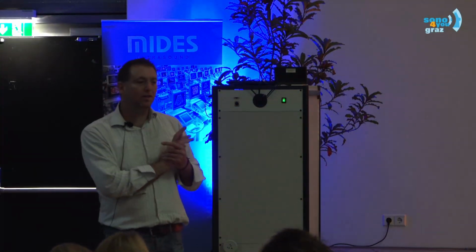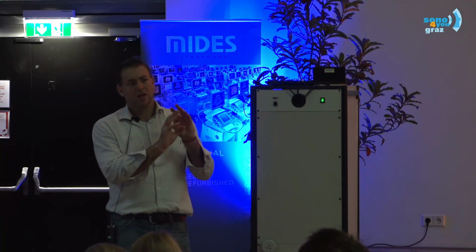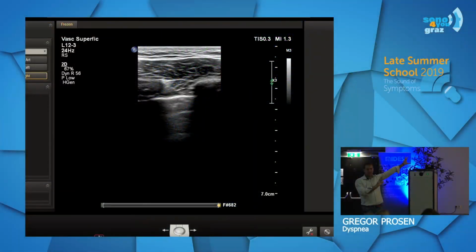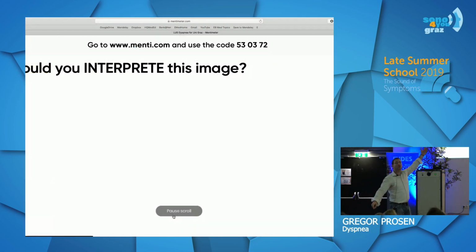Why I want to push you is that you understand that, like with EKG, one thing is to describe this black and whiteness, okay? And another thing is, and we will scroll next, how you then interpret this image.